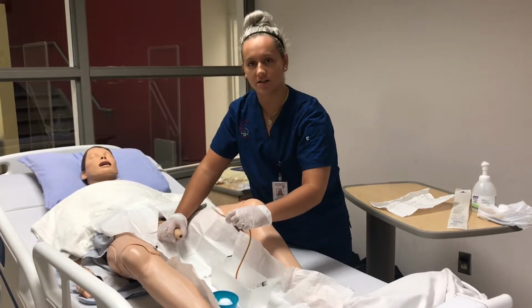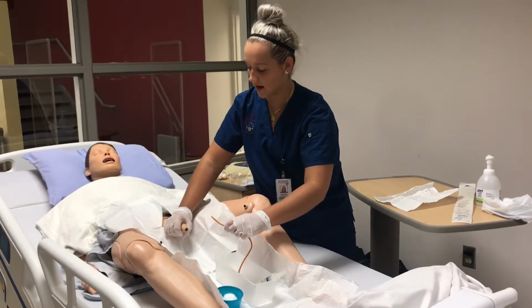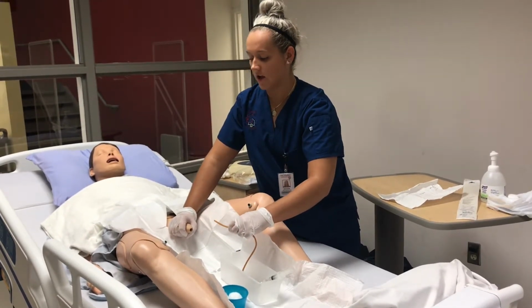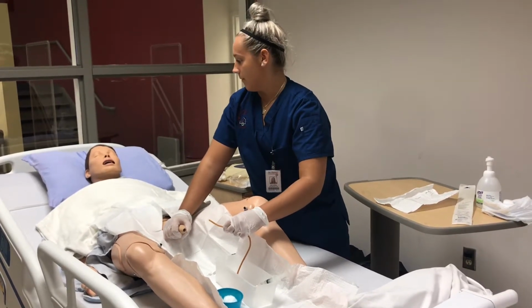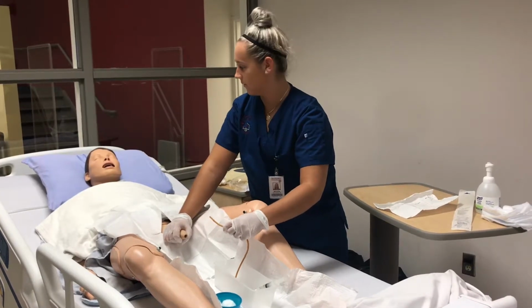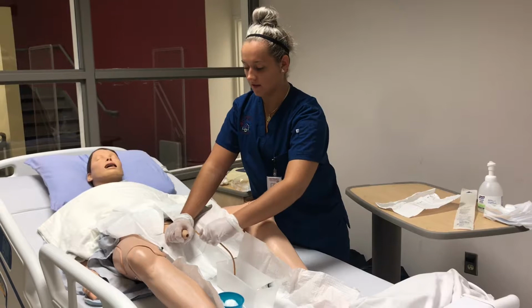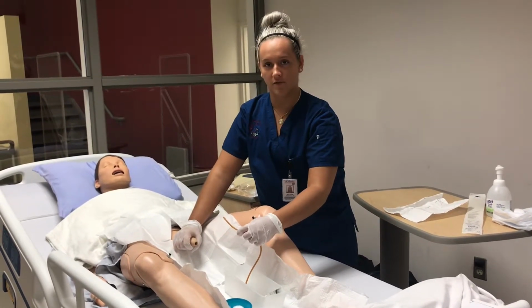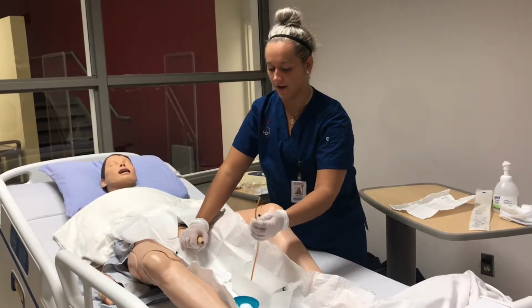And then you're going to want to slowly insert it into the shaft of the penis, making sure that it's straight so that it slides into the urethra easier. You're going to want to do this in a slow motion and be aware if the patient feels any pain, and ask them if they feel any discomfort. If you can't insert the catheter, be mindful that it's very common for men to have prostate issues, so you might have to take the catheter out.